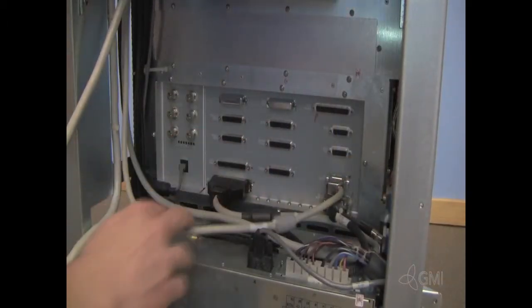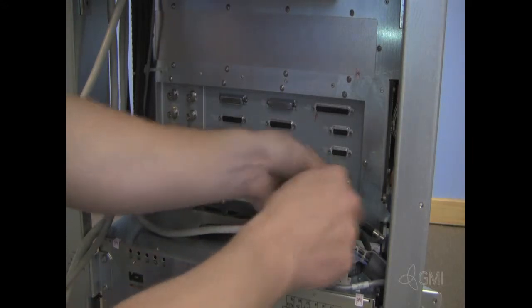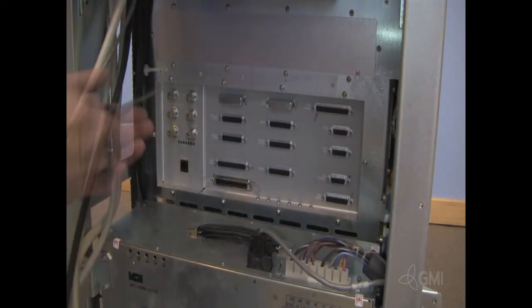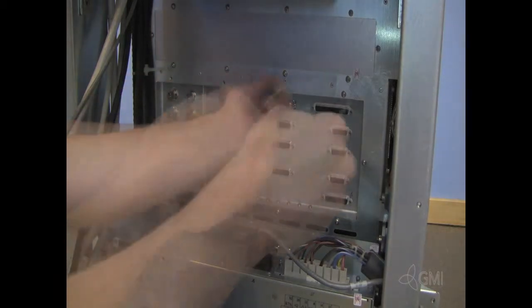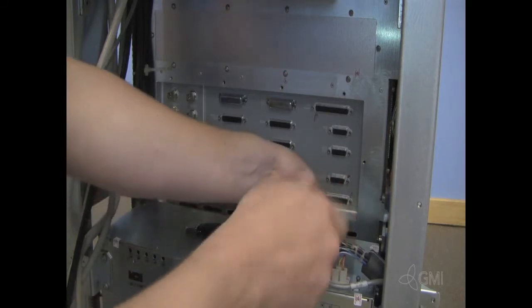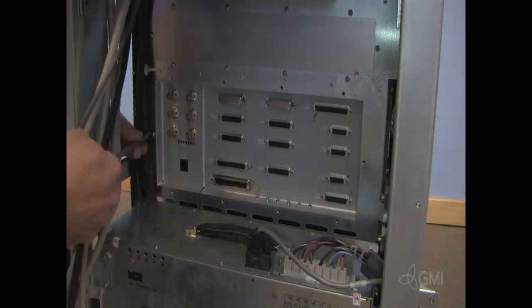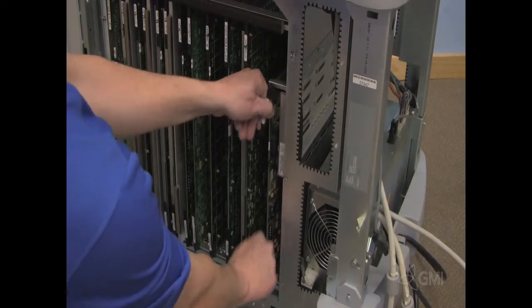Remove all cables attached to the PIC. Remove the screws securing the PIC to the chassis. Using the pull tabs, eject the PIC from the card cage.